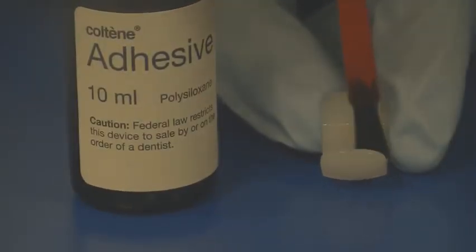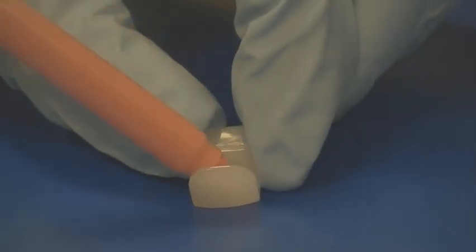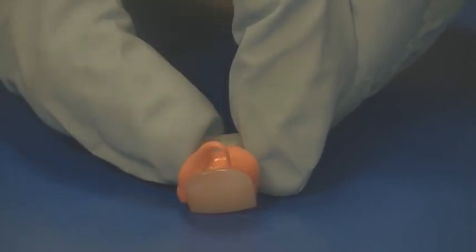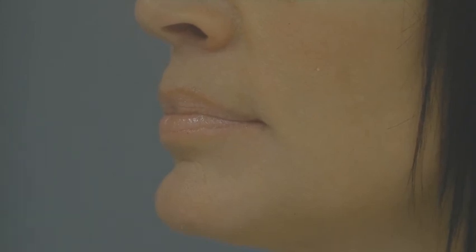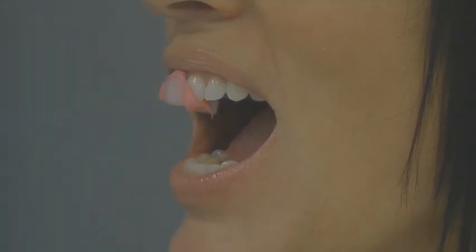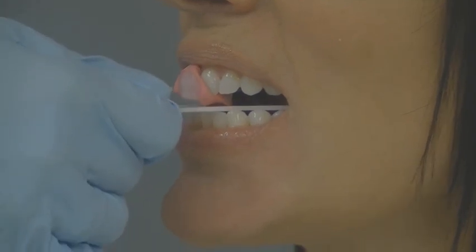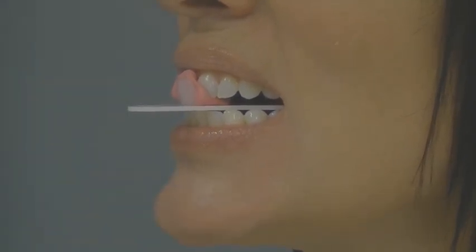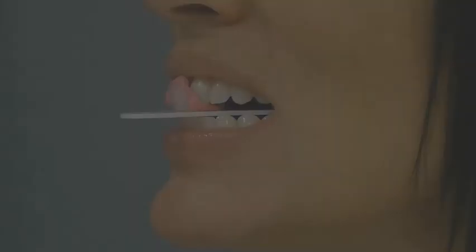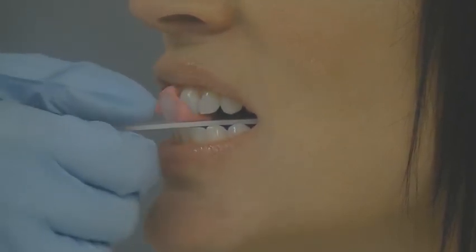Paint the inside of the Lucia jig with a small amount of silicone tray adhesive and allow it to dry for one minute. Dispense AccuFlow bite registration material into the same area. Place the jig on the upper centrals and place the whale tail directly beneath the jig. Ask the patient to bite down and hold. The whale tail's job is to level and orient the jig to the occlusal plane. Allow the AccuFlow to set for about 45 seconds, then remove the whale tail and set it aside, and remove the jig.